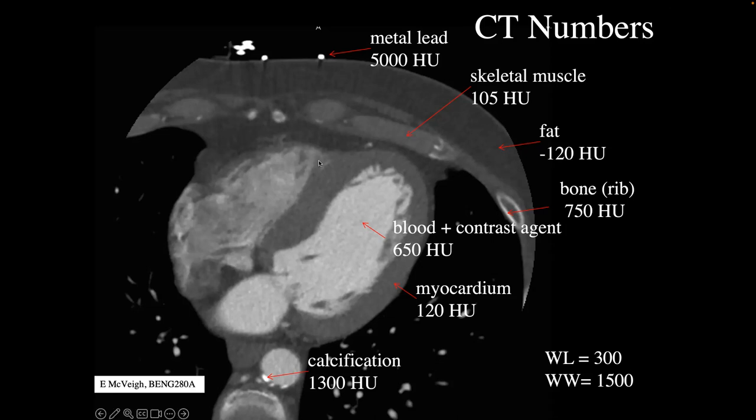That is the essence of the reconstruction: our data is the sum of the attenuation through, say, for one angle, through all of these voxels, like 500 voxels. And it's the sum of the attenuation through all of those. But we get enough of them that we can do this inversion to figure out which one is which. And that's the essence of the reconstruction.